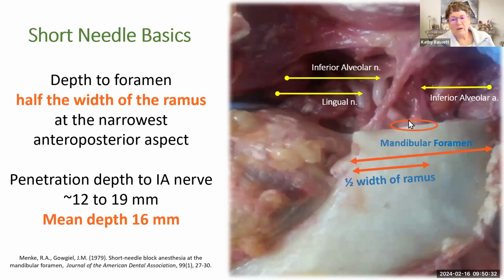We traditionally use a 25 millimeter short needle, so we've got it standardized. We always use that needle. And so we're using a common measurement, and I easily have approximately 6 millimeters still available after that insertion.